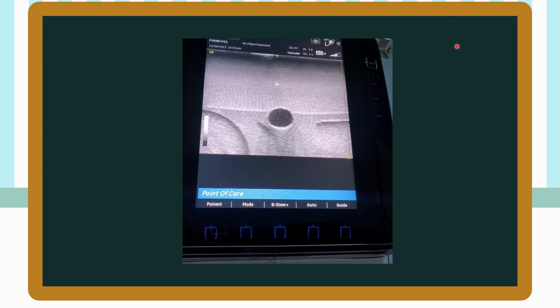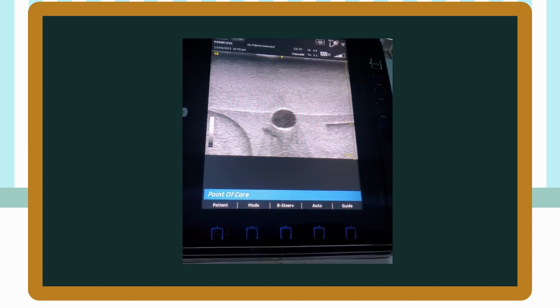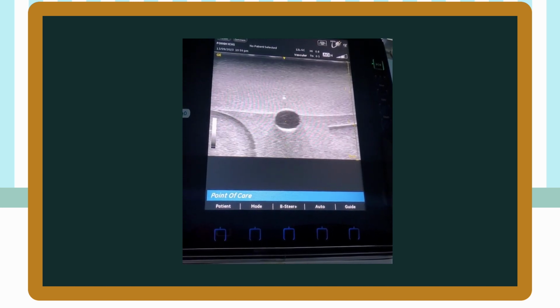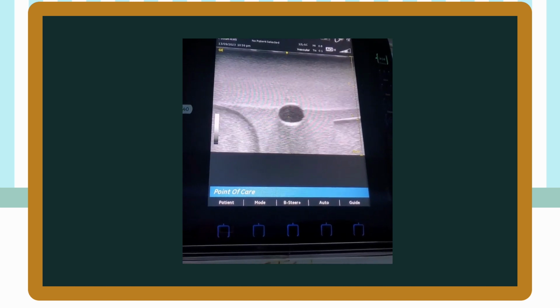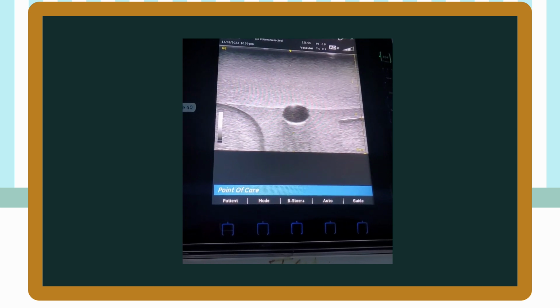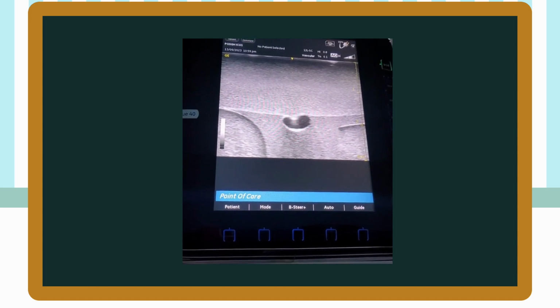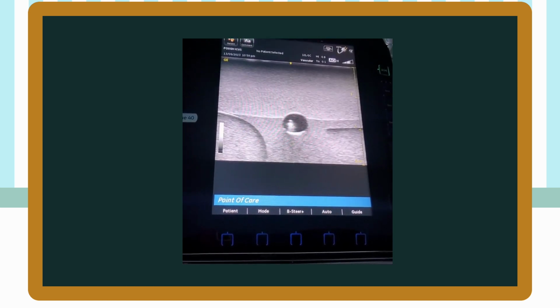As the ultrasound probe moves forward, the image of the needle tip is lost, and then the needle is advanced to meet the ultrasound probe and it appears again. This procedure is repeated. As the needle tip approaches the anterior wall of the vessel, the anterior surface is seen to be distorted. As the needle advances further, it pops through the anterior wall and enters the vessel.